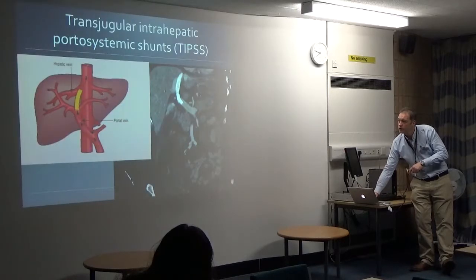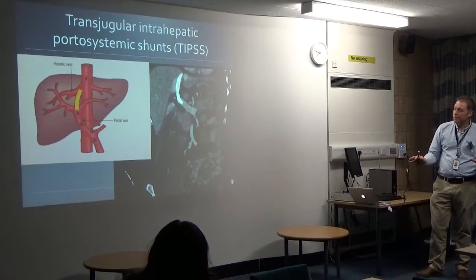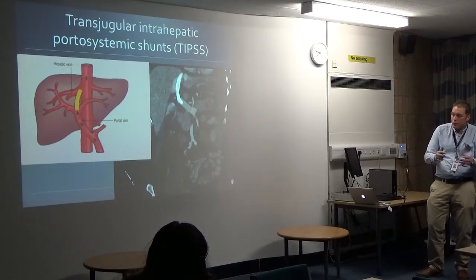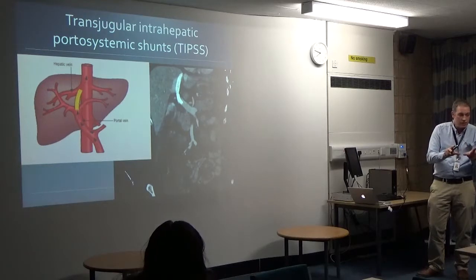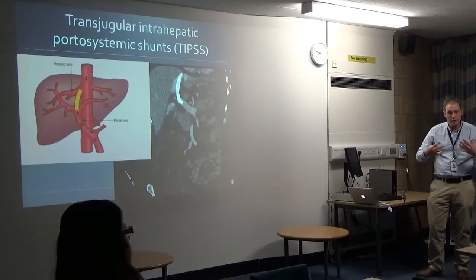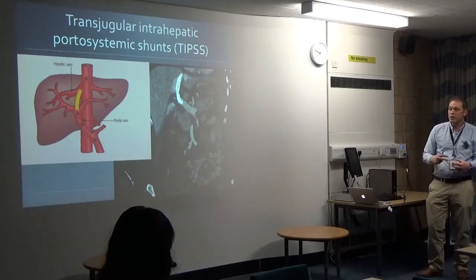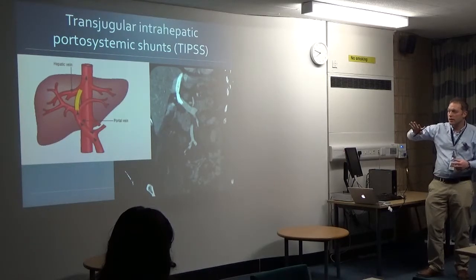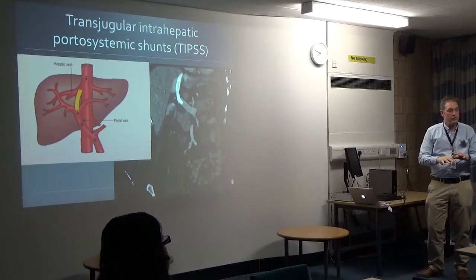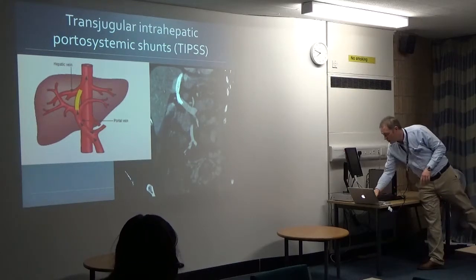So I've just included this because obviously you're a liver group. We do the TIPS procedures. We do them when patients come with bleeding from varices, or dilated blood vessels relating to having cirrhosis, or they have a problem with ascites, so fluid in the tummy that keeps coming back, recurrent ascites. Then we can make a little path in the liver between the portal vein, the supply to the liver from the gut, and the hepatic vein, which is the vein that drains the liver out. That takes the pressure off the dilated veins in the tummy, and enables the ascites to settle down and stop being such a problem. So that's one thing that we do, but I'll move on.